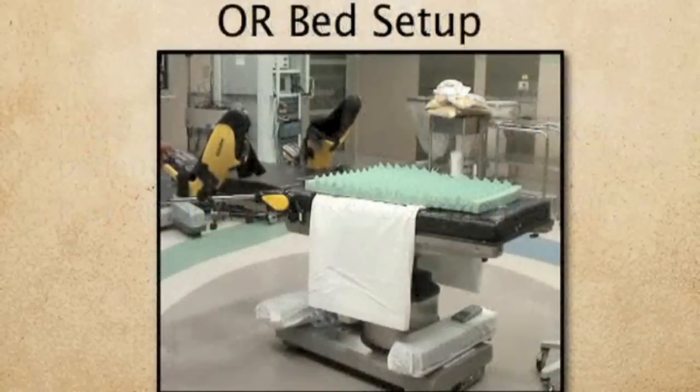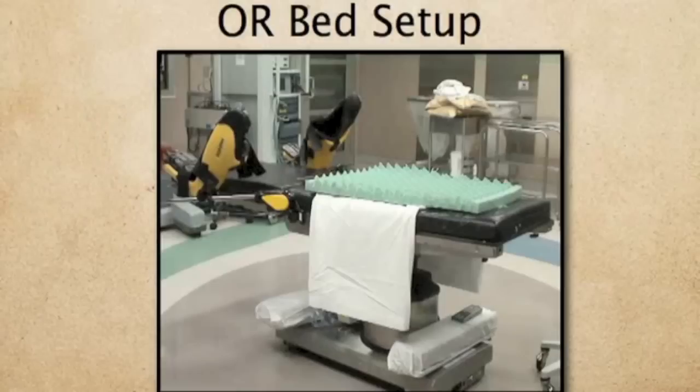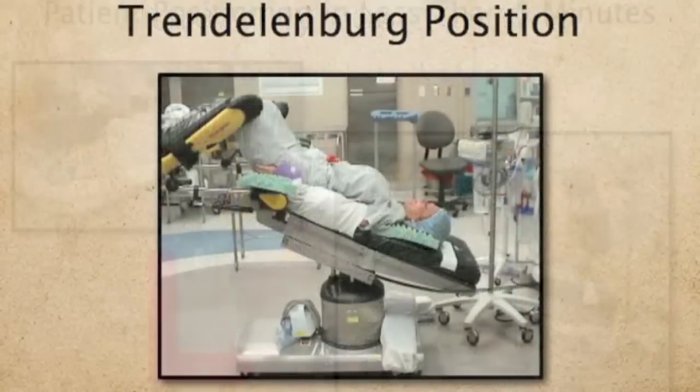Again, we recommend the use of a bed sheet with an egg crate foam mattress with boot-type stirrups. The hips should be flexed approximately 170 degrees, with the knee and foot aligning with the contralateral shoulder, and the hips abducted 90 degrees or less. The arm should be tucked at the side with cushioning, with the hands pronated. This technique can help reduce a patient's risk of a postoperative neuropathy.